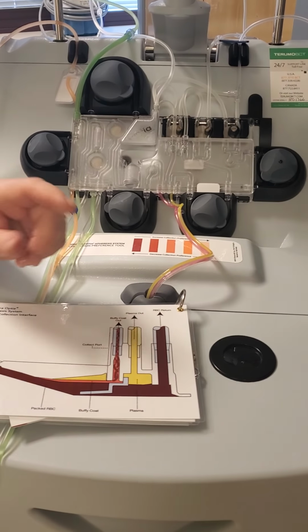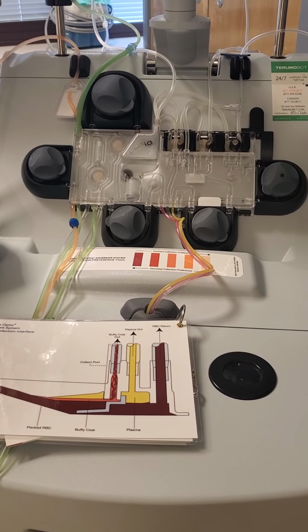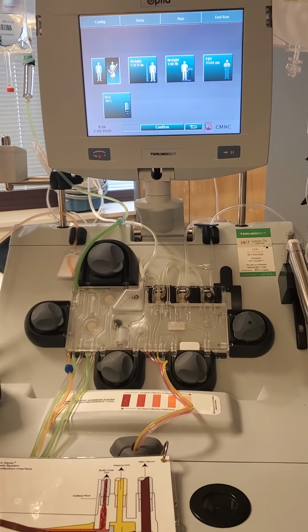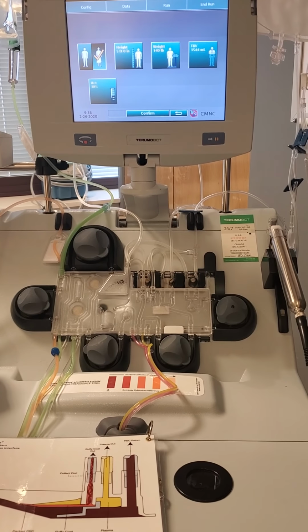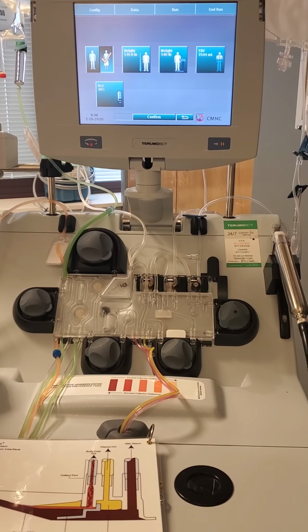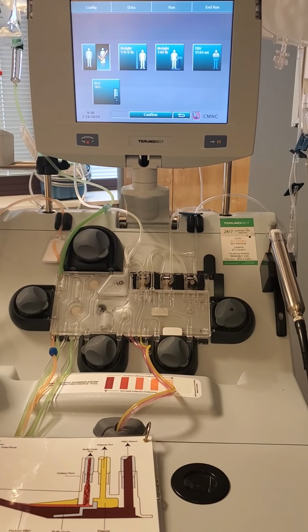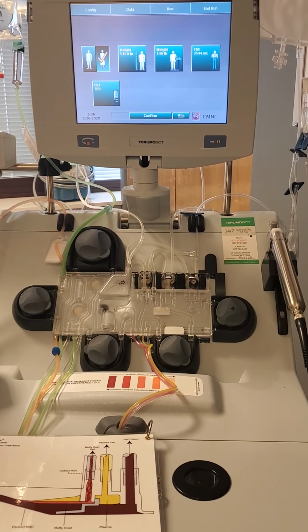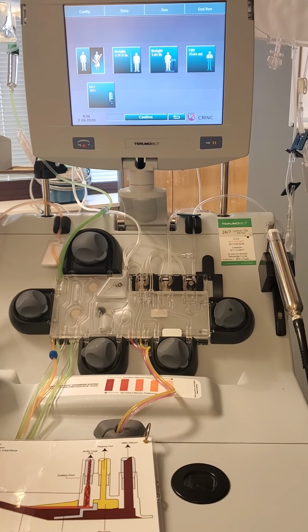All right. Because we entered a crit that's way too high, we should get an interface alarm. The name of the alarm is interface taking too long to establish. What piece of data will the troubleshooting suggest we correct? Probably adjust your hematocrit level. Right. Not probably, but it will. I like causing this alarm, and I'll tell you why. Because troubleshooting it is really a challenge. You have to dig through 5 causes to get to the actual cause for your alarm.